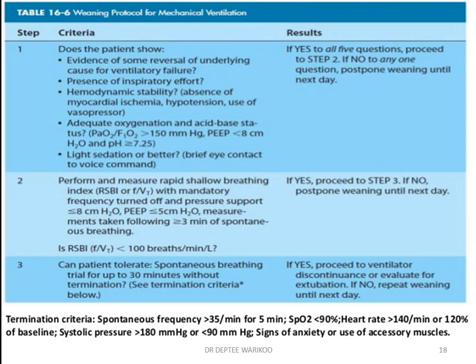Extension tubing of 60 cm long should be attached to the exit to prevent entrainment of room air in case the patient's inspiratory flow exceeds the system flow rate. The airway is then suctioned. Then the patient is disconnected from the ventilator and given oxygen, or you can use CPAP as comfortable. Encourage the patient to breathe and monitor for signs of labored breathing.